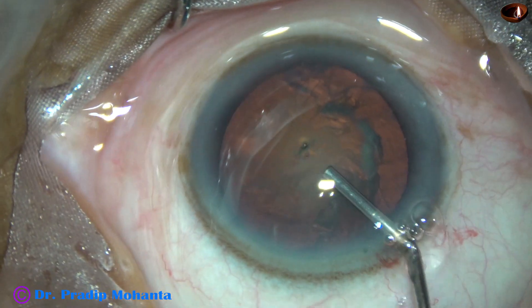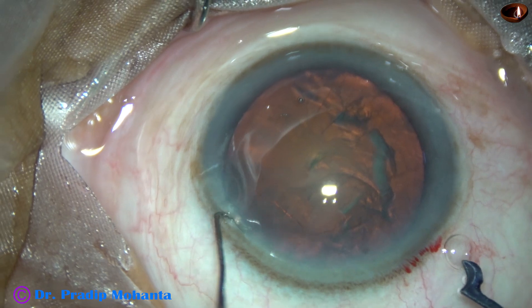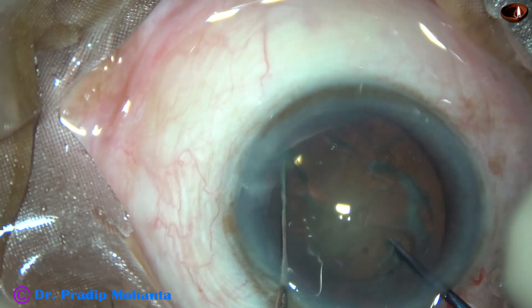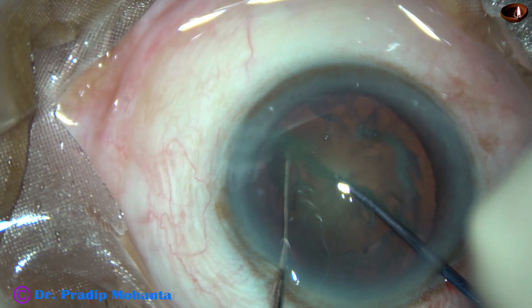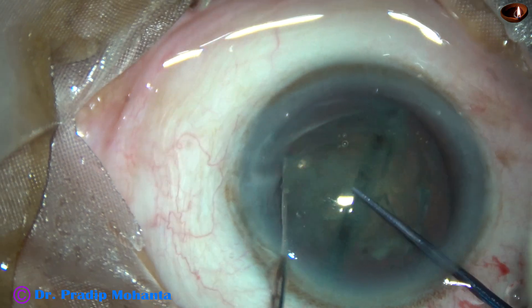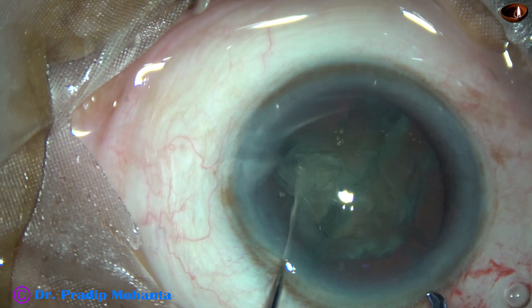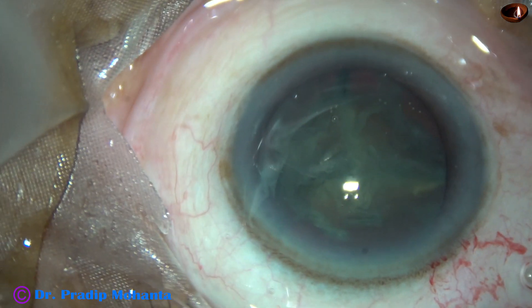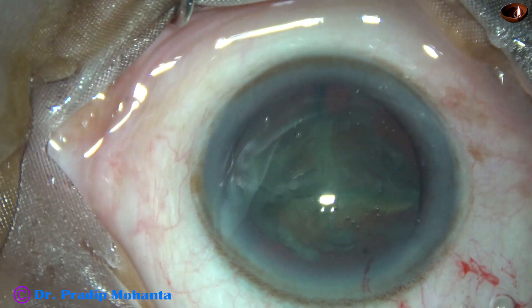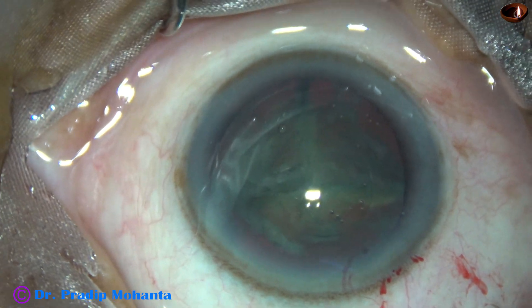Some visco is used to fill up the anterior chamber. Now I am going to use this pre-chopper — this is Dr. Sohail Khan's pre-chopper. See how beautifully you can divide the nucleus with this pre-chopper. One hemi-nucleus is being divided into two pieces by the same pre-chopper. So we have got three pieces: one hemi-nucleus divided into two pieces, and another hemi-nucleus. This is enough.